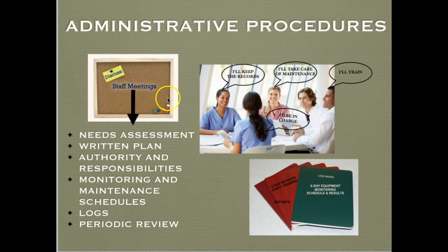So hopefully your staff is going to volunteer and someone will keep the records, or somebody will take care of the equipment, maybe go out and get additional training and come back and train the staff, and then someone to be in charge of all of these areas. It should be written down.